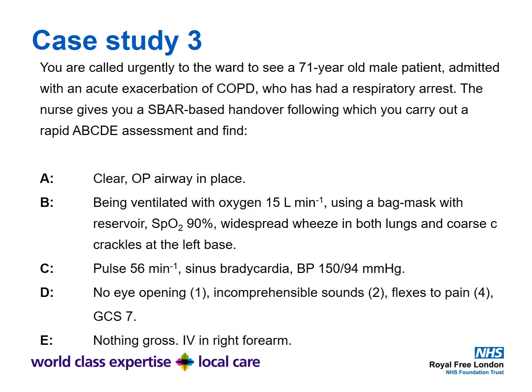So immediate things that should jump out to you are the fact that he has an oropharyngeal airway, which means the patient is unconscious. He's being ventilated with 15 litres of oxygen. I want you to ask yourself at the moment about, is that the right thing to do even though they have COPD? And remember, the answer is yes, for now. Remember that even with COPD, it is not hypercapnia that will kill these patients, it is hypoxia and terminal ventilatory failure. Obviously, we don't want a patient like this on 15 litres of oxygen for prolonged periods.